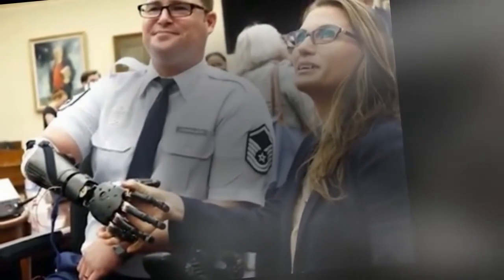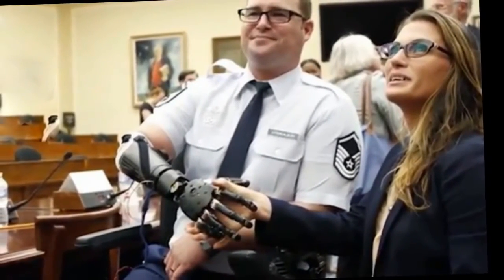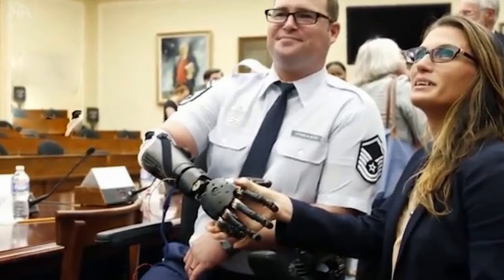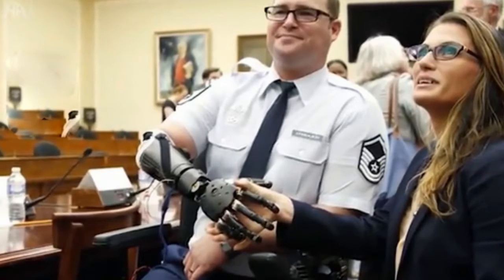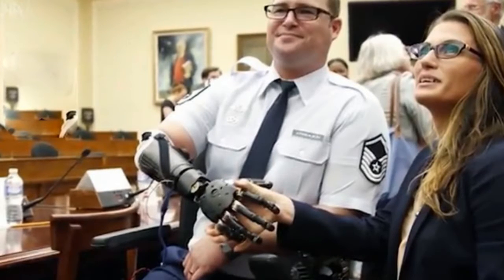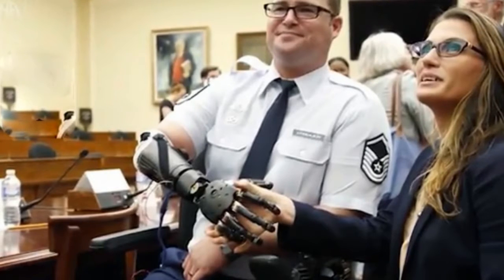"Before, the only way I could put the prosthetic on was by this harness with suction and straps, but now, with osseointegration, the implant does away with all that," said Matheny after the MPL was attached. At first, researchers planned to move forward cautiously after the MPL was attached to Matheny's body by Richard McGuff, Chief of Musculoskeletal Oncology at the University of Pittsburgh Medical Center. But Matheny had done research and was prepared, allowing the exercises to launch right away.